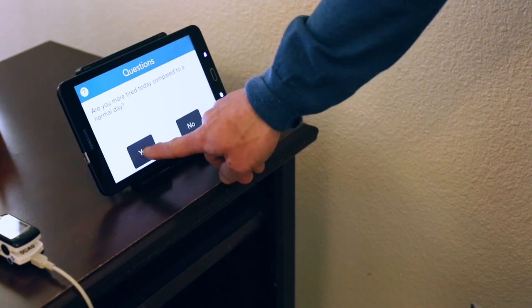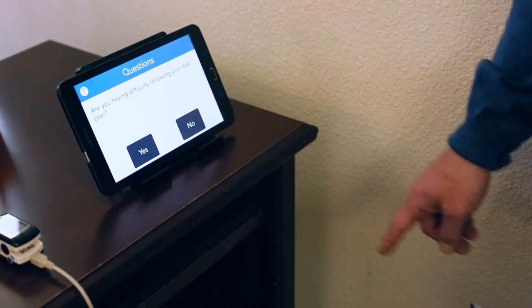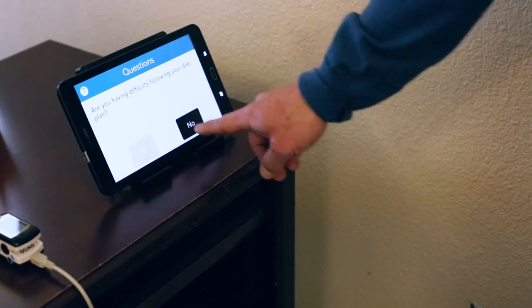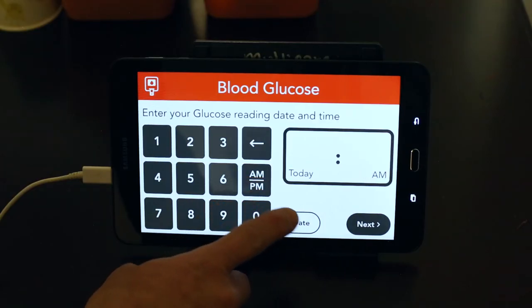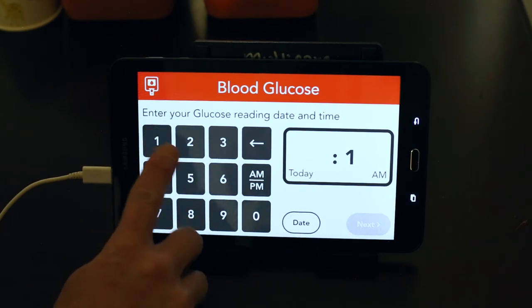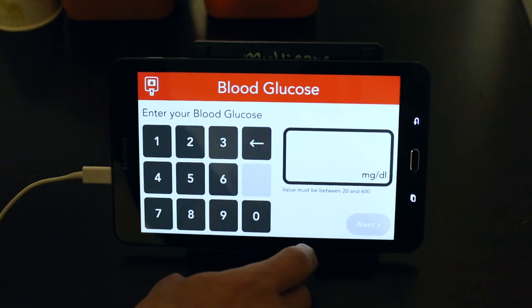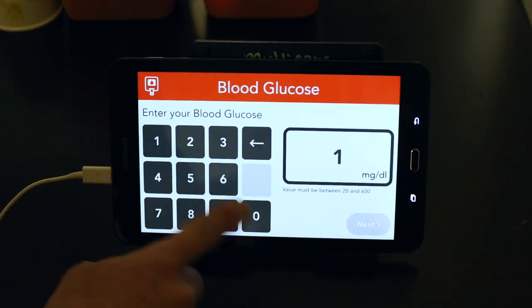Please note that if you answer yes to any questions, your clinician will contact you, and if any of your readings are too high or too low, they will also contact you. If your blood sugar is being monitored, be sure you take your reading before you eat. Write the reading down if you need to so that you can enter it when it's time to check your vitals.